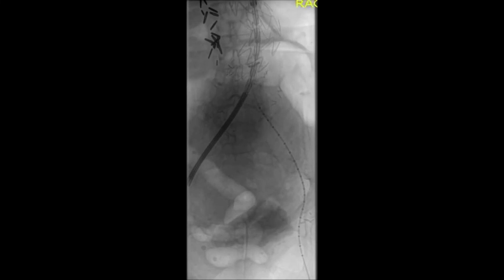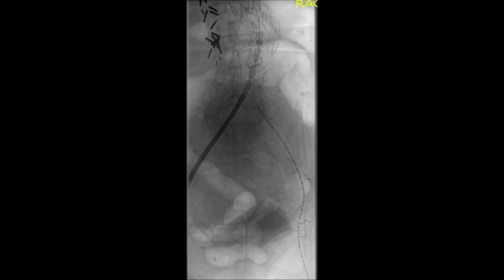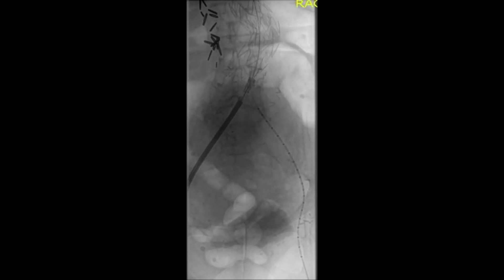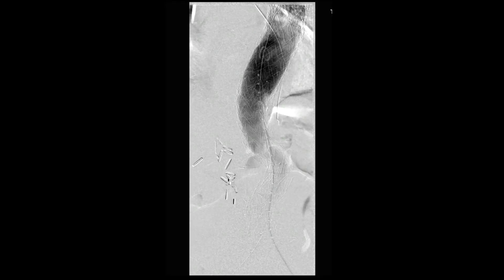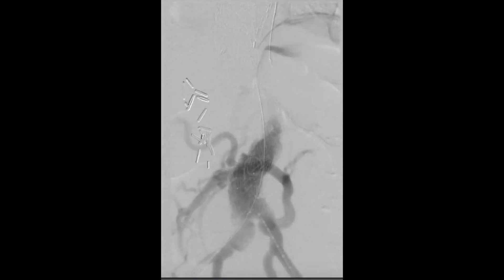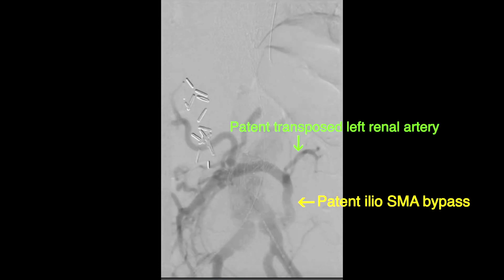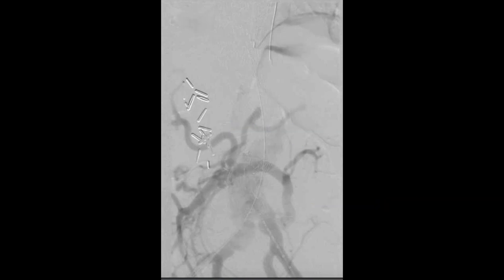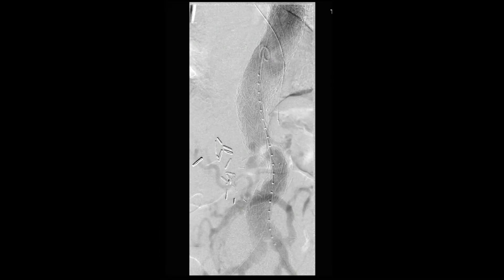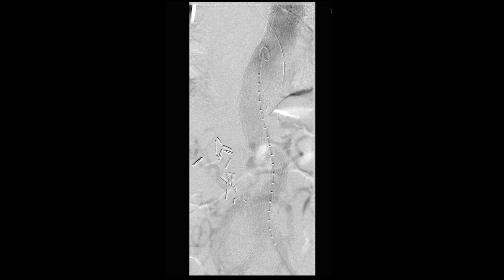We then brought in another 28 mm Navion stent graft and deployed it just distal to the previously placed Navion stent graft, making sure not to cover the origin of the bypass to the SMA from the left iliac limb. A completion angiogram was then performed that showed no evidence of active extravasation or contained rupture, and confirmed a patent left ilio-SMA bypass and a patent transposed left renal artery onto this bypass.